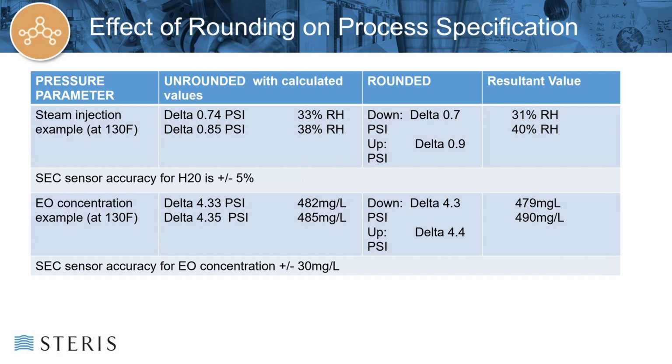When we talk about time increments, time is exceptionally important in the sterilization process because there's a lot of time and effort that goes into understanding how long the cycle needs to be, how much chamber time it takes, what the turn time is or the cycle time for your product in general. You want to get your product into and out of the process as quickly as possible. You don't want to eat up machine capacity by making the process too long.